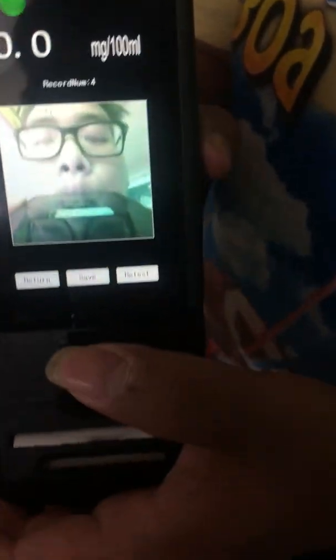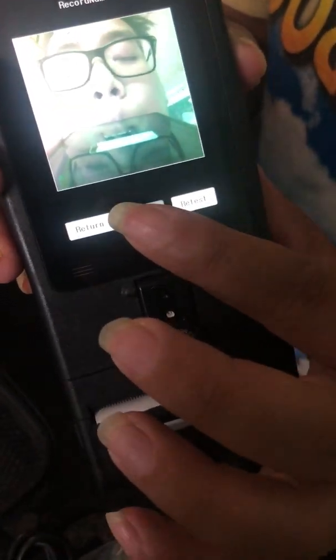Now, in a second, it will show my face here. After that, you can put it back and press save.